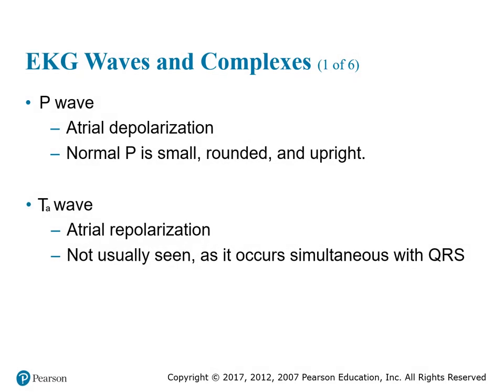Welcome back to Chapter 2, the electrophysiology lecture. Today we'll be covering EKG waves and complexes. As you know, depolarization and repolarization of the atria and ventricles result in waves and complexes on EKG paper. Today I'll be deciphering what each one of those waveforms means.